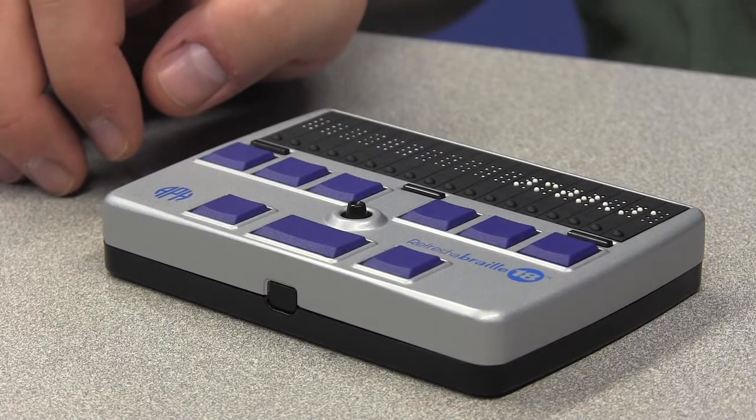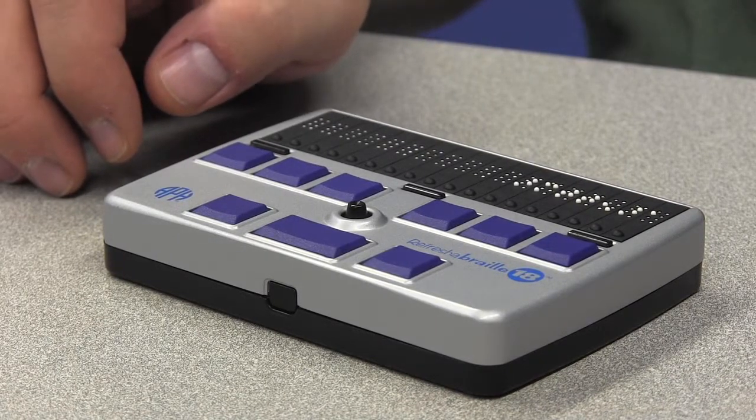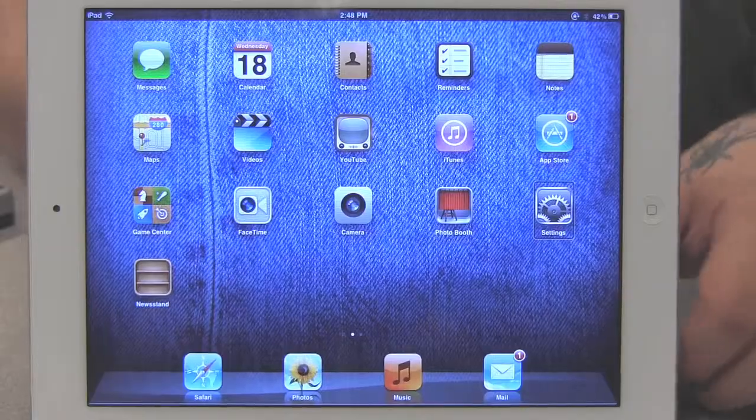The only difference in pairing a Bluetooth Braille display with the iPad is that instead of going to the Bluetooth screen as we did with the Bluetooth keyboard, we're going to be going to the VoiceOver screen under the accessibility window.